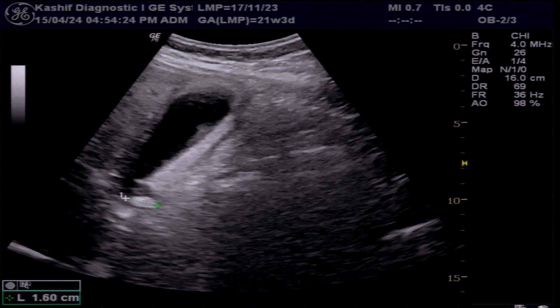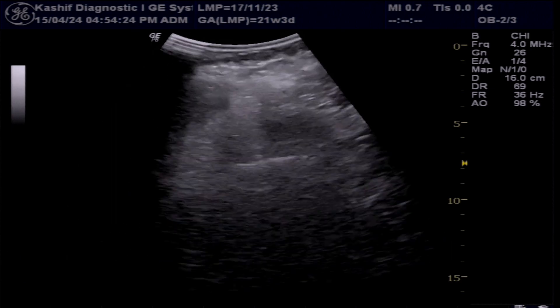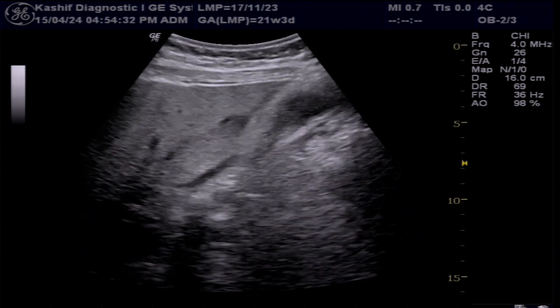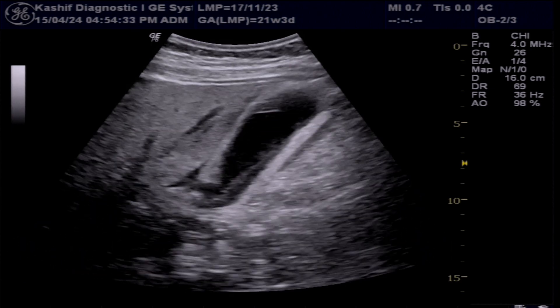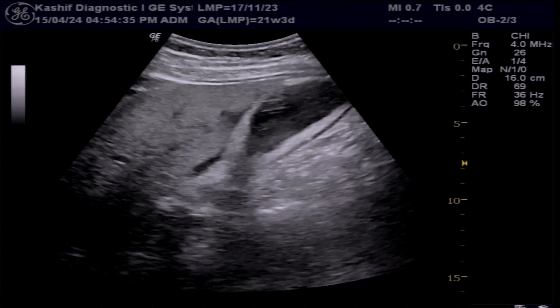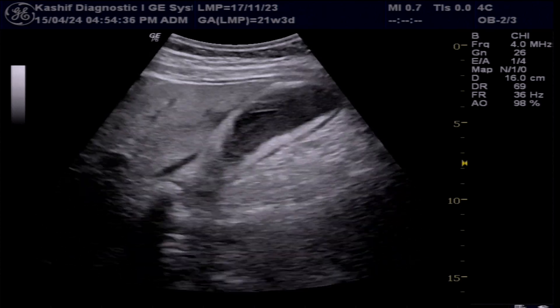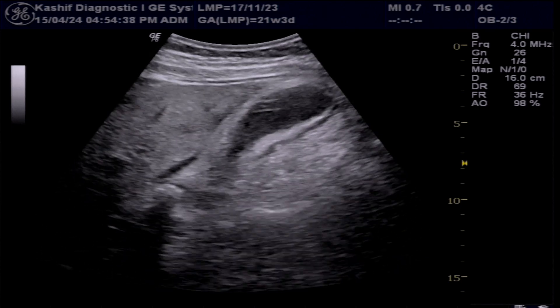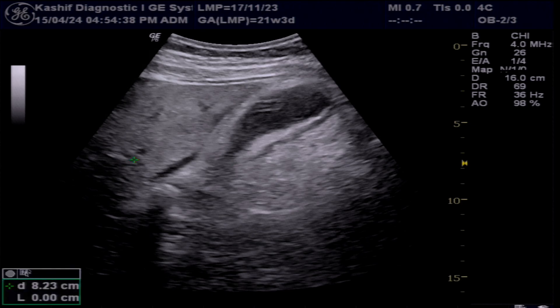This is a complication of the gallbladder stone causing infection of the gallbladder. Gallbladder stones are more common in overweight and fatty females close to 40 years of age.